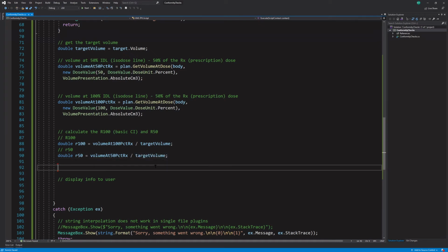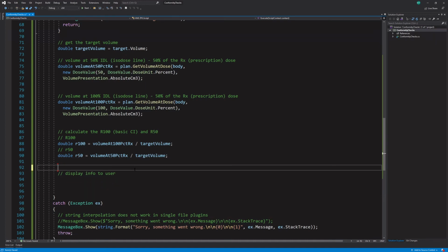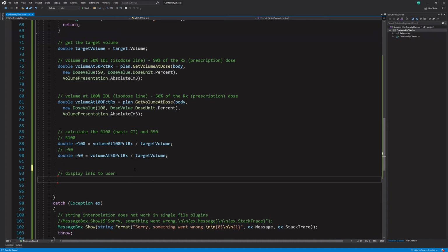Okay, and then we want to display it to the user. So let's do a message box dot show, and we'll need to do a string dot format.